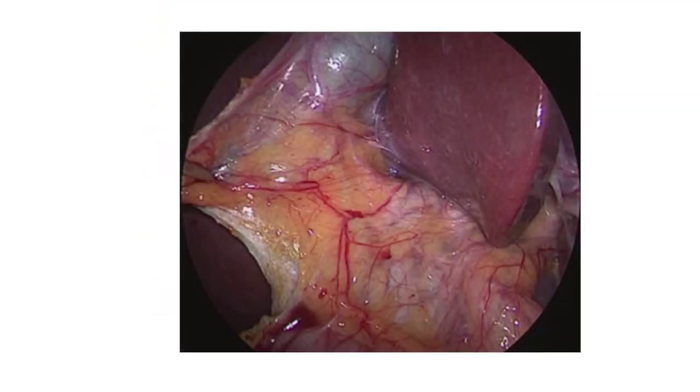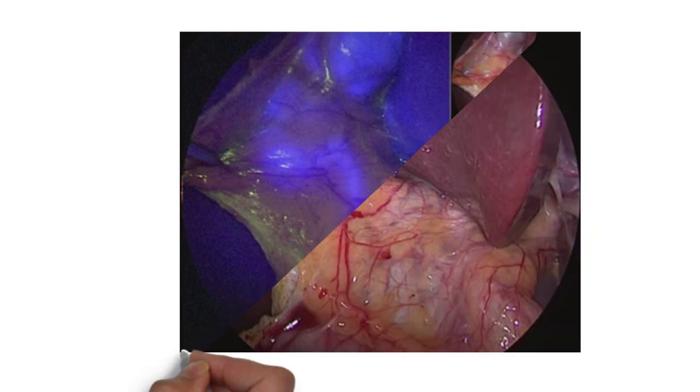This infrared light can actually penetrate into tissue, allowing the surgeons to see information below the surface in real time.